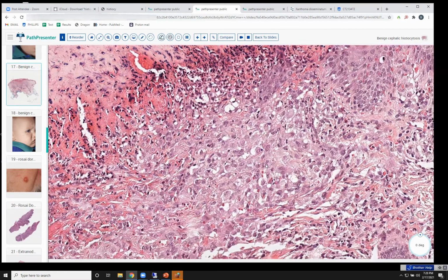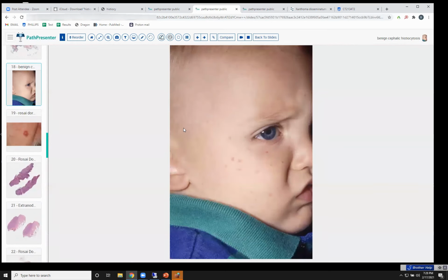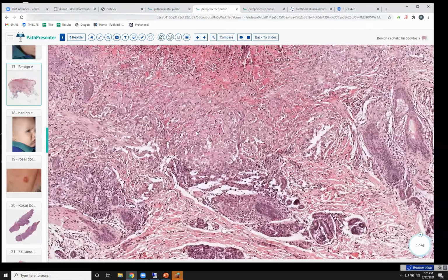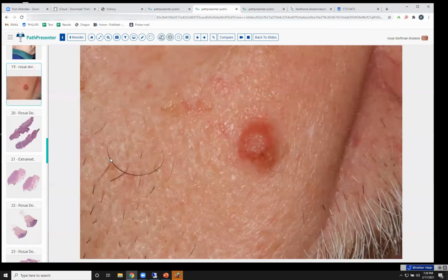They're not so well. Here's another one. And here's another picture of this. And these, again, you have to have the clinical because, as you can see, in the xanthogranuloma family, it's either xanthogranulomatous or reticular histiocytoma-like, and then the division. So the next one is Rosai-Dorfman.